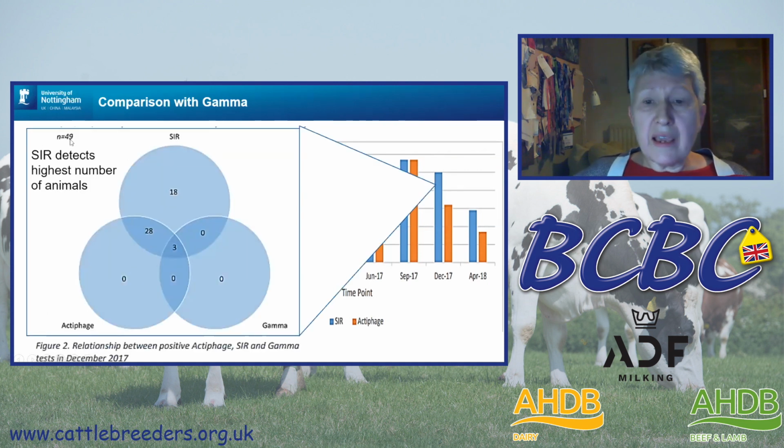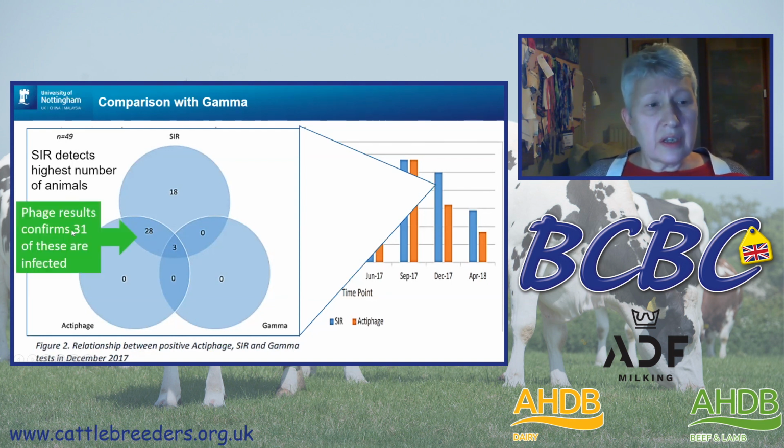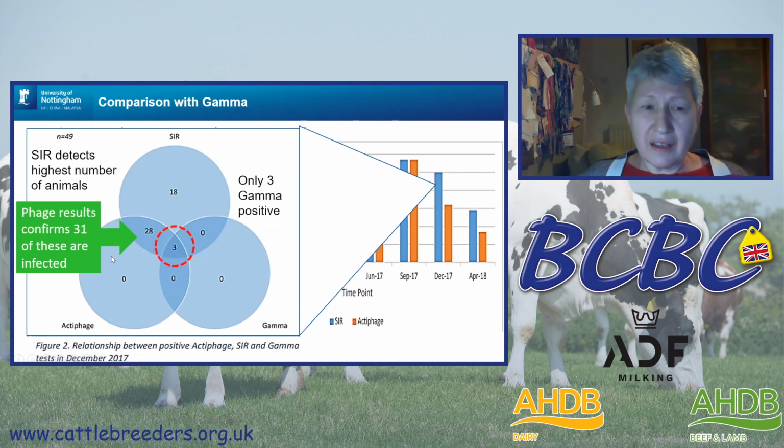So 49 SIR animals were identified in December 2017. And of those, 31 gave us a positive phage test result. So we were pretty confident, patterns were going the same way, that we get a lot of these animals and we can show that those animals are infected. However, only 3 of those gave a positive gamma result. Now, interestingly, it was the same 3 that gave a positive result with all 3 tests we tried.